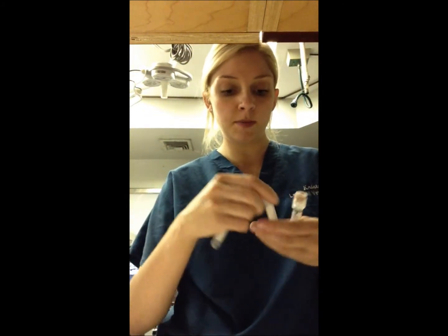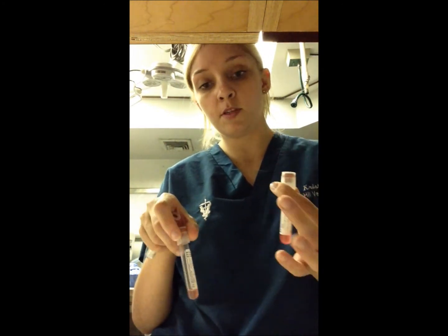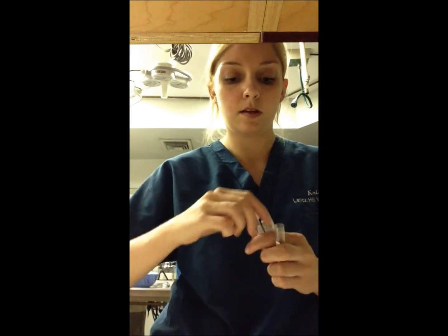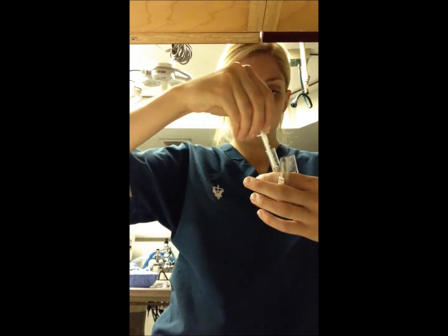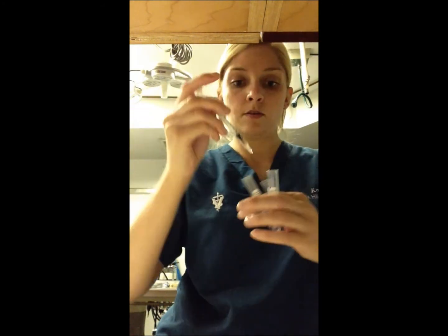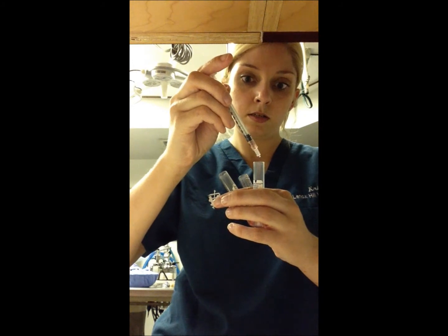For the minor cross match, basically what you're going to do is place 2 drops of the donor serum and 2 drops of the recipient's erythrocyte suspension into a vial. So we're putting the serum in, 2 drops, new syringe, the erythrocyte suspension, 2 drops, and you allow that to incubate. Basically, for the control vials, you're going to remix the erythrocytes with the serum for each patient.